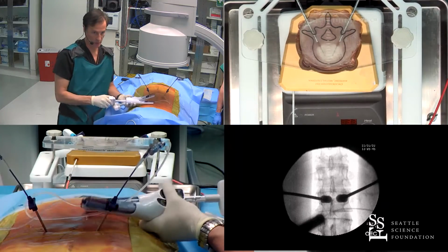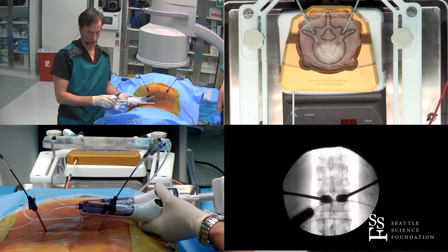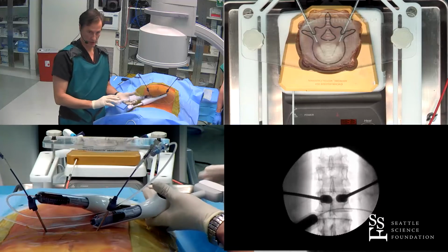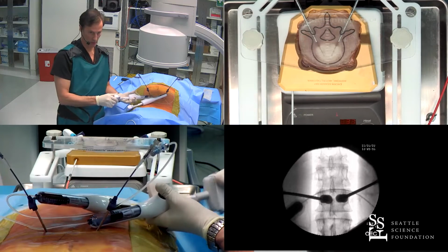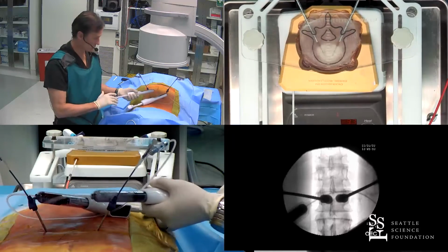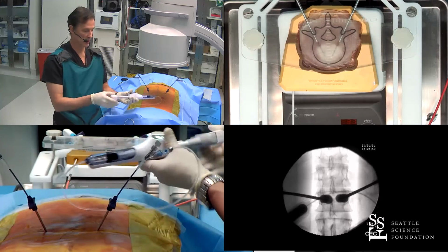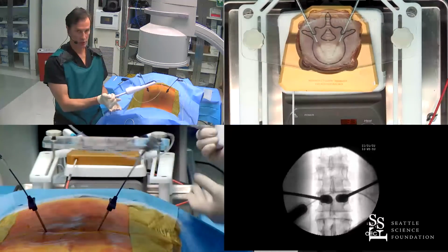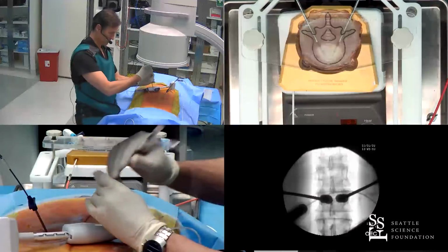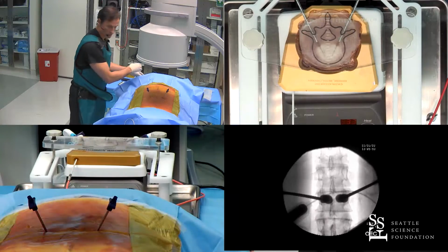And inflate both balloons up a bit. So once we do this, appropriate amount, very nice, we will now inject some cement. And these, you can either deflate the balloons by counterclockwise motion or by triggering it. And this brings it down very fast. Balloons out. And cement.